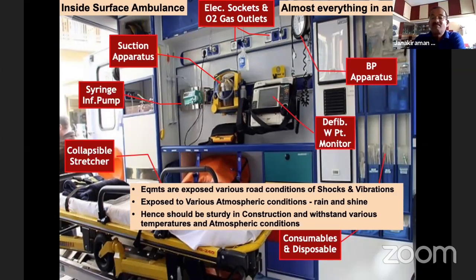They may not have great functions, but they are sturdy in operation. They are exposed to various atmospheric conditions like rain and shine. So it should have a splash test certification. Hence should be sturdy in construction and withstand various temperature and atmospheric conditions. So this is an ambulance inside. The equipment inside the ambulance are slightly different than the ICU equipment. So does the testing matter?